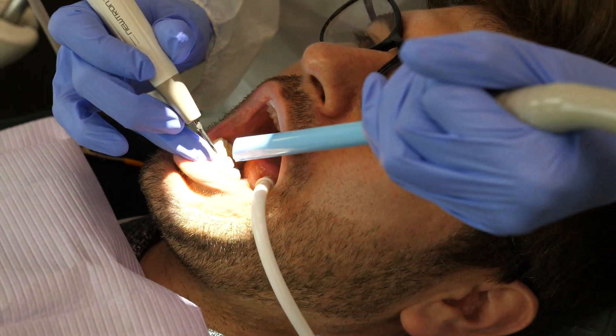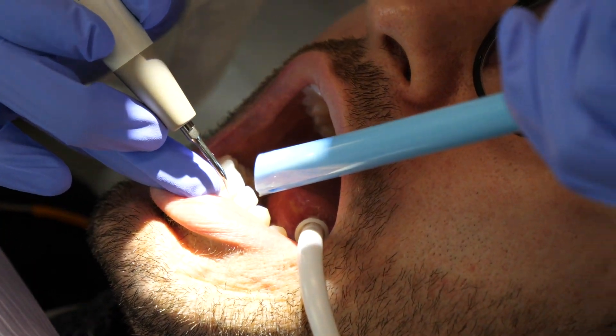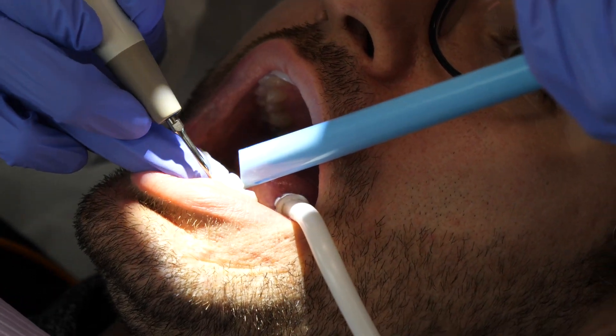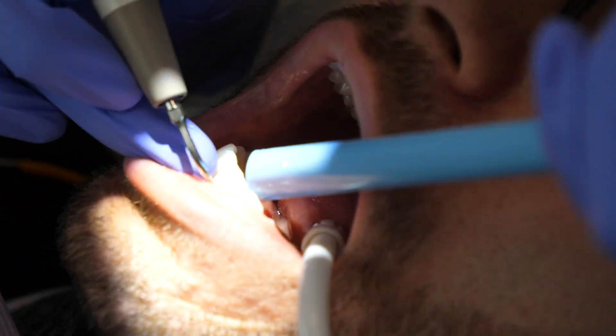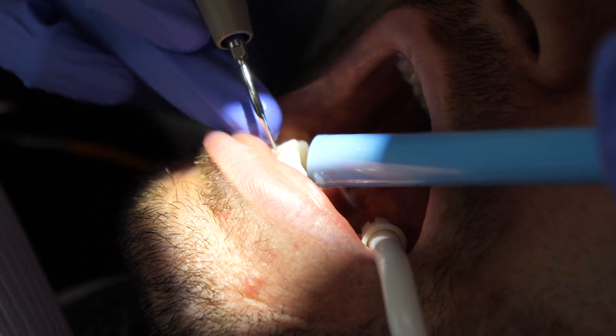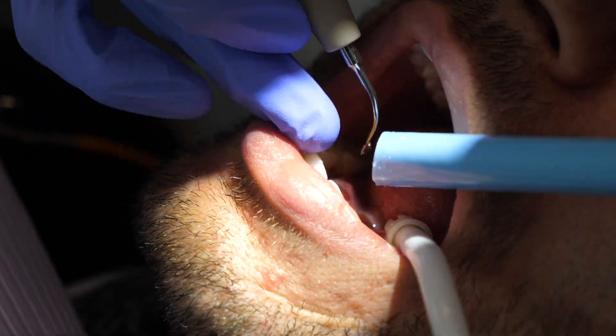I use what I've got, starting with the ultrasonic. The ultrasonic scaler is always a great tool to start with — it really removes the bulk of a large piece of tartar. No matter how tenacious it is, starting with the ultrasonic works best for me.